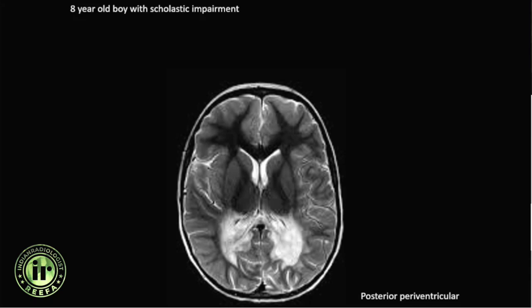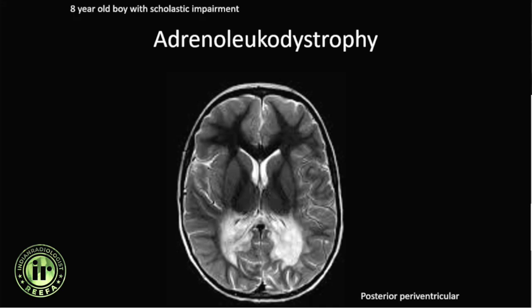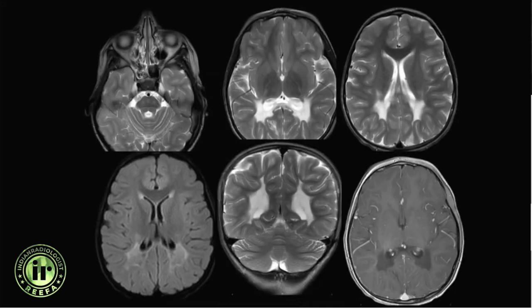Another patient — an eight-year-old boy with scholastic impairment — showed typical peritrigonal signal abnormality also involving the splenium of the corpus callosum. This is a very characteristic age and gender presentation, as this is X-linked adrenoleukodystrophy (ALD), which is much more likely to be seen in boys.